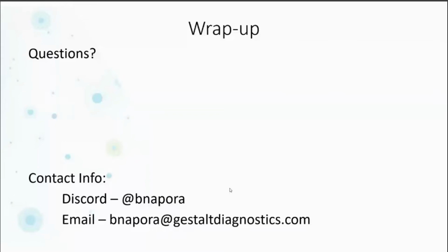I had a little question about your picking up of the annotations associated with your tiles. Does your database have an implementation of that, or did you just scan through them all, or were you using a quad tree or something to efficiently pick up the annotations that associate with the tile? Yeah, we scanned through all of the annotations on the whole slide.